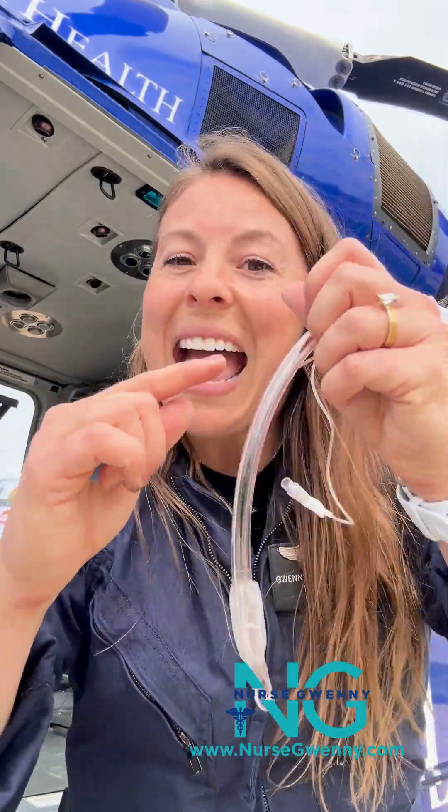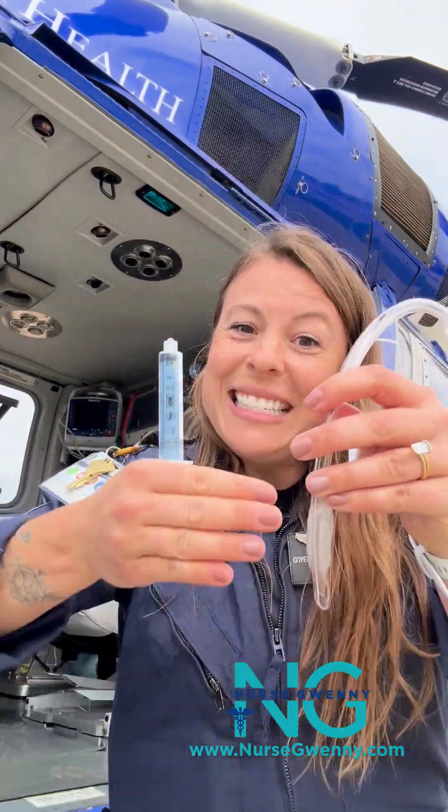We're all familiar with the cuff here on the ET tube. The purpose of this cuff is to eliminate that negative space — that opening in between the outside of the endotracheal tube and the lining of the tracheal wall. Because when we're pushing air through this down to the patient's lungs, we don't want it to escape around the edge. So the cuff keeps that from happening.